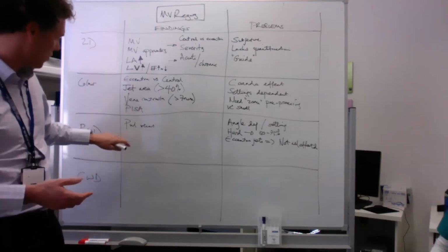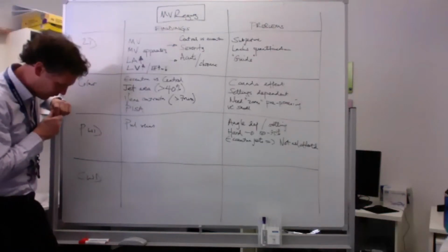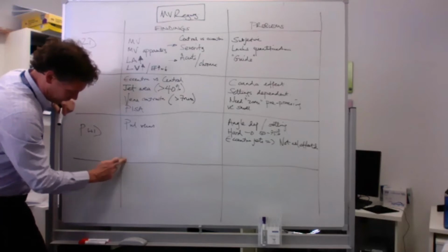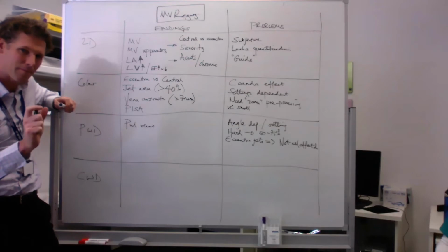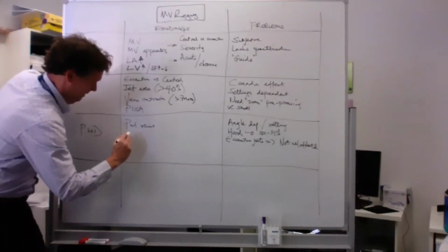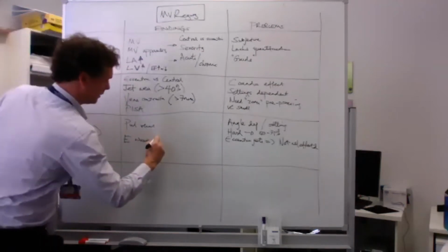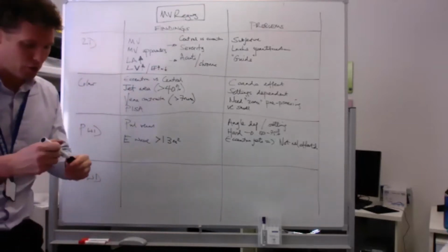What about another one that's good for pulse wave Doppler? You can look at EA waves, but they're not particularly helpful. Not quite EA, but you're on the right track. Well, what about a high E? Yeah, nice. What's your cutoff? It's about 1.2 to 1.3.